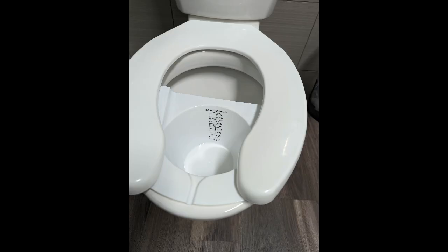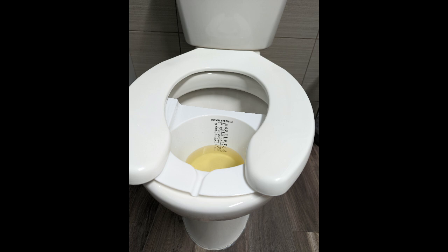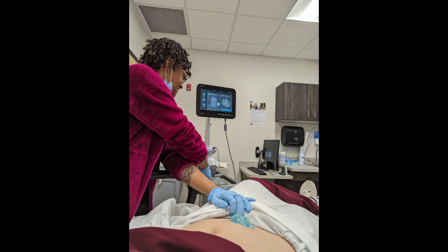When the patient gets the urge to spontaneously void, have the patient call the nurse to the bedside, assist them to the bathroom and have them void in the hat. Record this volume as their voided volume. Immediately after they void, check a post-void residual with a bladder scanner and record this as the post-void residual in the chart.